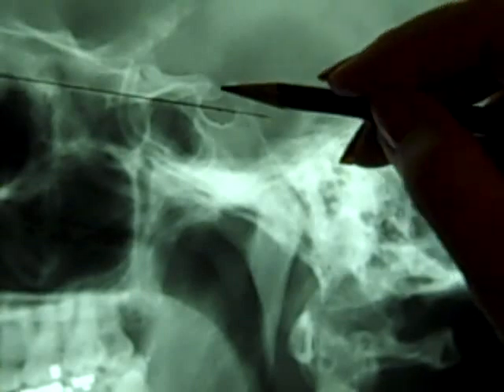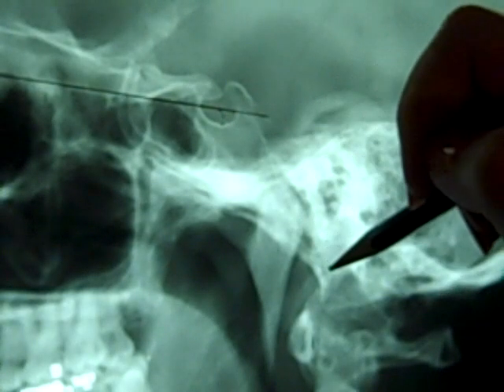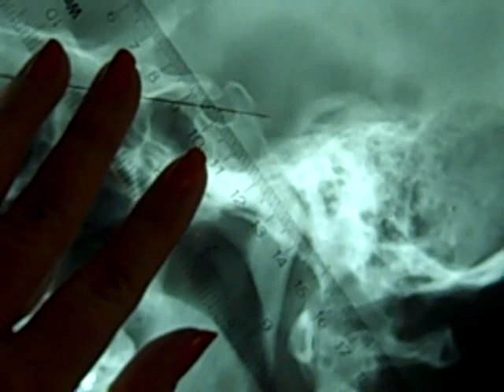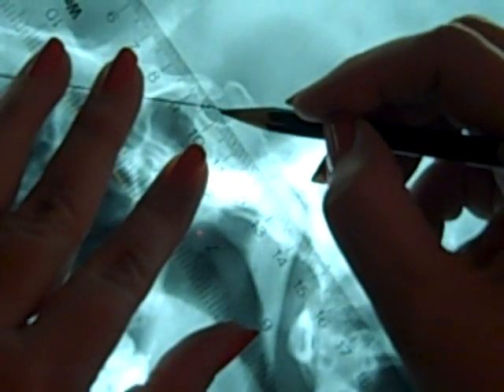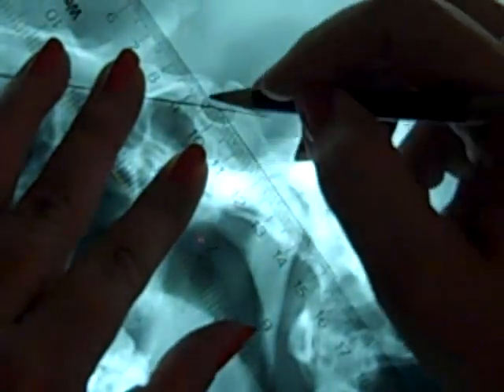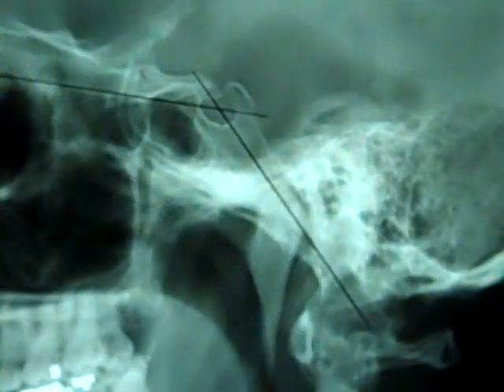Using the center of the sella turcica and the anterior portion of the foramen magnum, I'm going to draw my second line. And then that will be basilar angle.